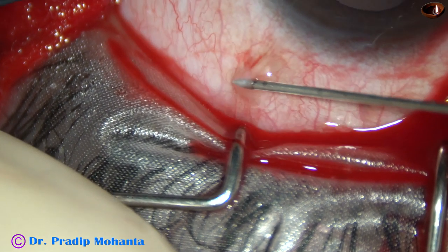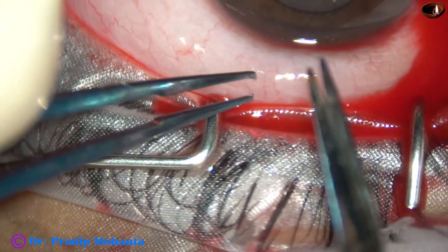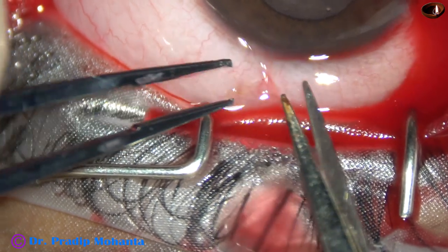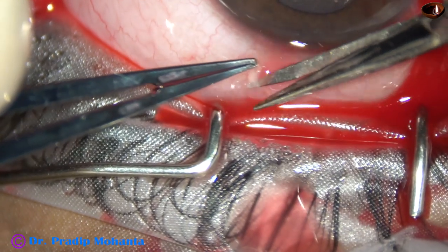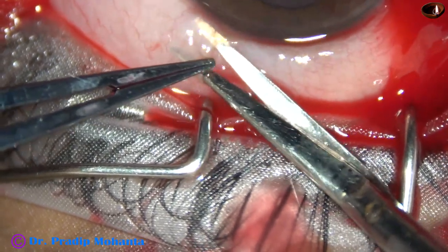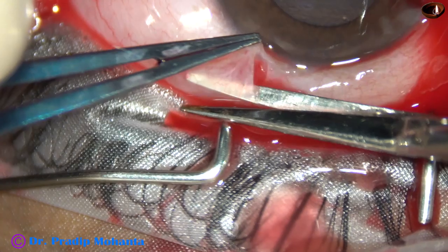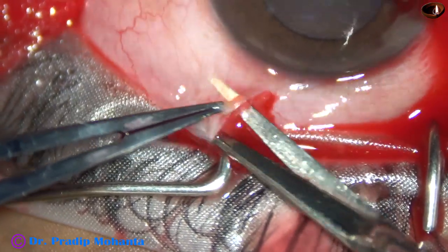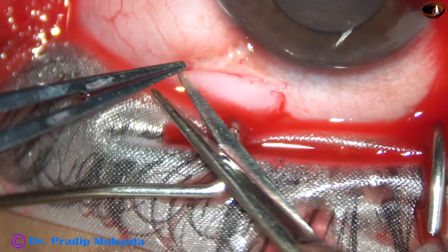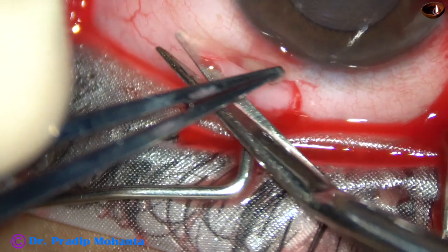Now I am going to get the donor tissue. It is important to take only the conjunctiva and not the tenons — we should not cut the tenons. If we just take conjunctiva and leave the tenons, there can be primary healing, meaning the conjunctiva will grow over the tenons and remain as original tissue with original appearance. But if we cut the tenons, the area will heal by fibrosis, that is secondary healing. And if we need to do a trabeculectomy later on, this area cannot be used.